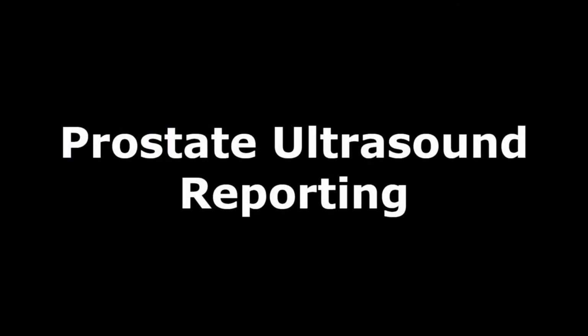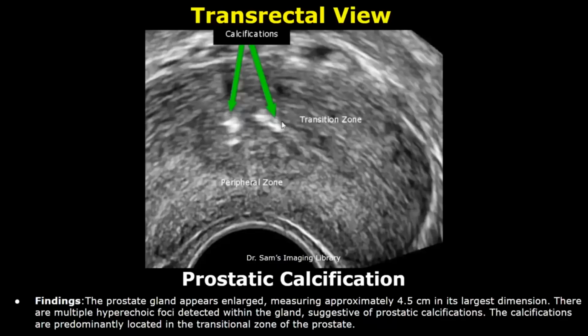And this video is about prostate ultrasound reporting. We will see how to write reports related to the prostate gland. The reports will include findings and impression.